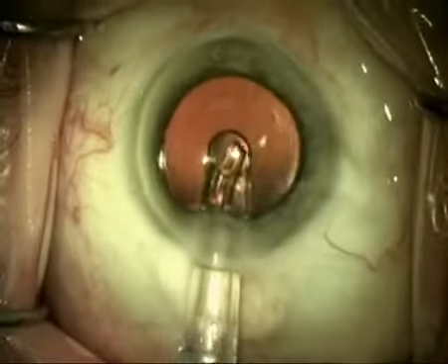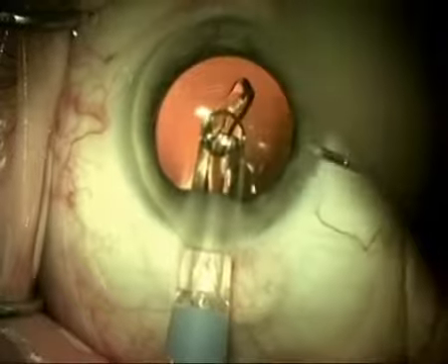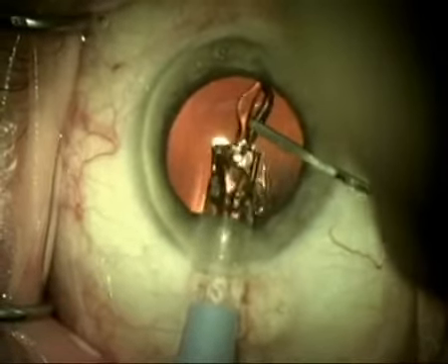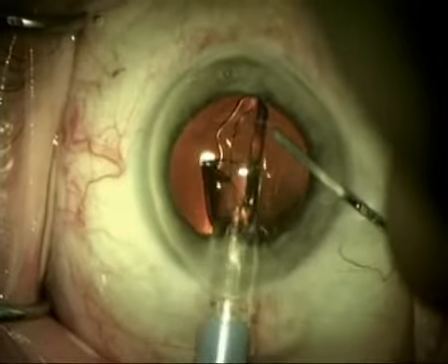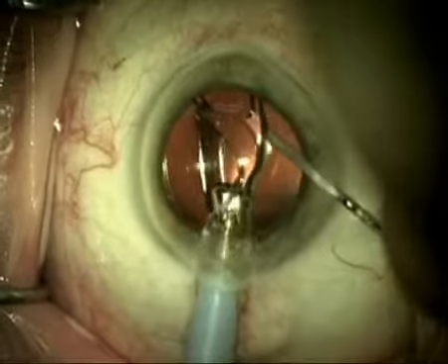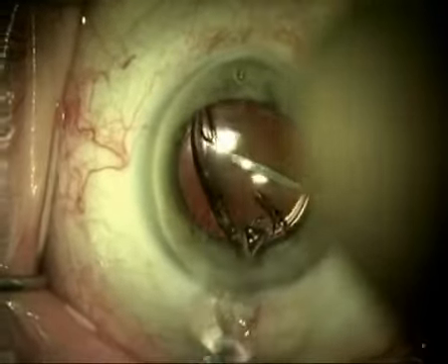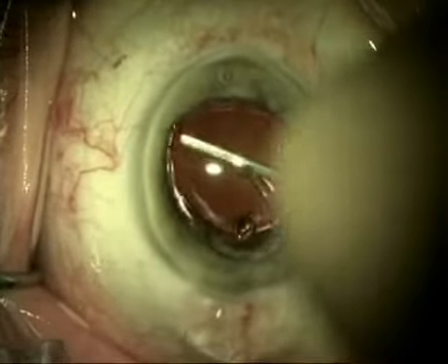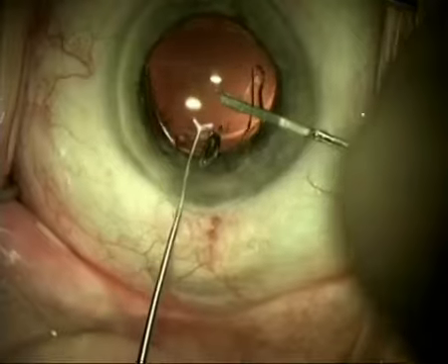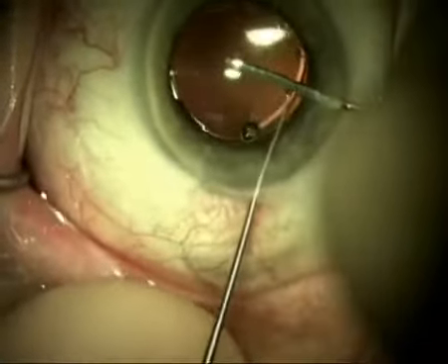As the lens slowly emerges from the injector tip, the leading haptic gently unfurls into the eye, followed by the symmetrical unfolding of the optic body and the trailing haptic. Should a direct sulcus implantation not be achieved, the trailing haptic can be easily positioned by means of a suitable second instrument. And here we see the lens finally being positioned in the ciliary sulcus.